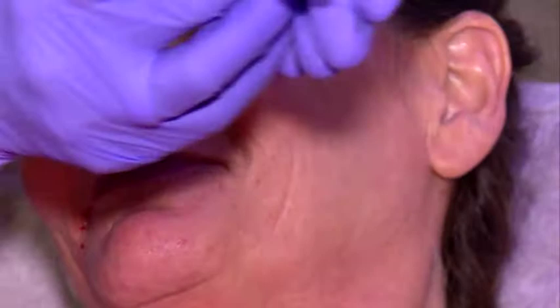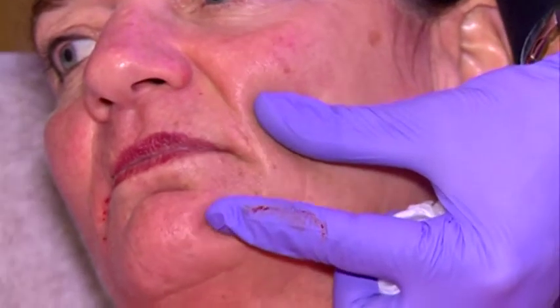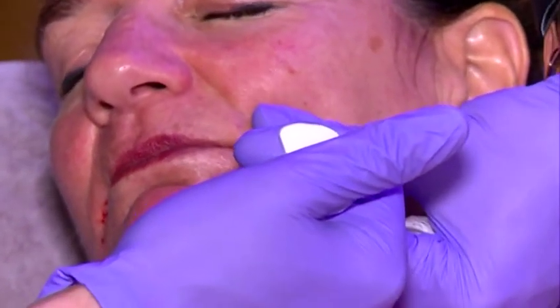This side was much deeper than the other side, but now it's pretty much the same. I can do the other one as well quickly, if you want. Yeah, please. Yeah, but we decided to finish the patient anyhow afterwards. See, here's much less of a depression. If I press it down, the other side was much more. I stretch it. Sorry, one more prick.